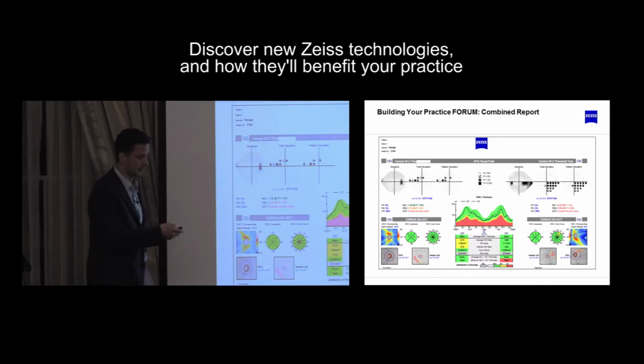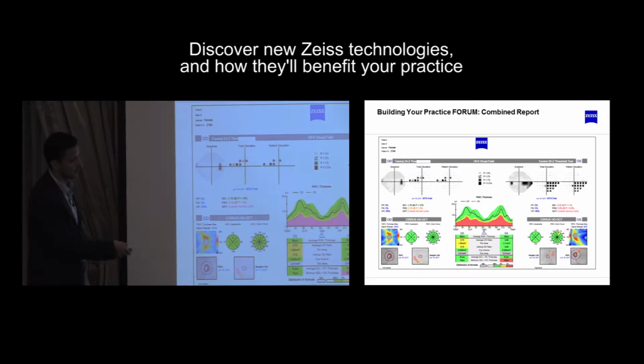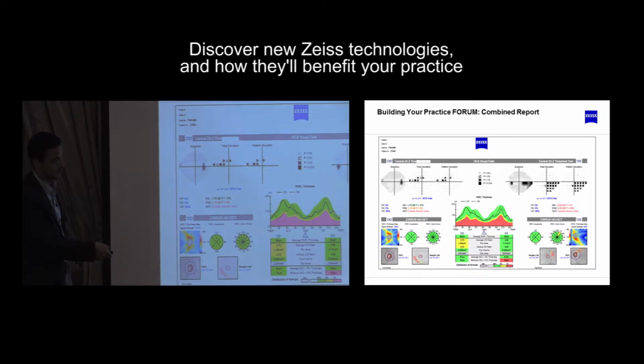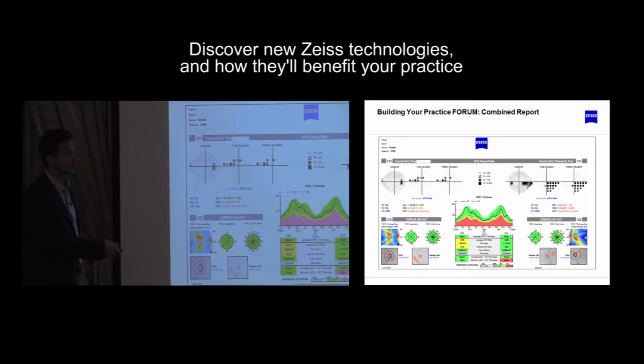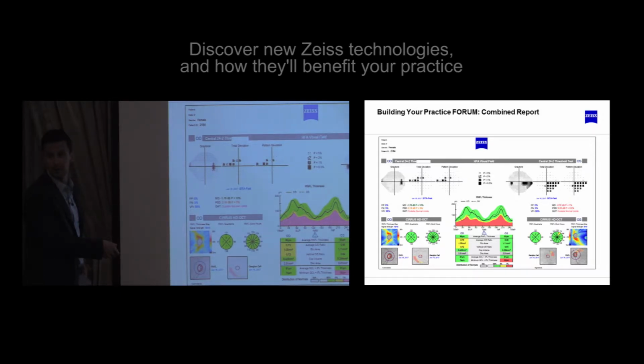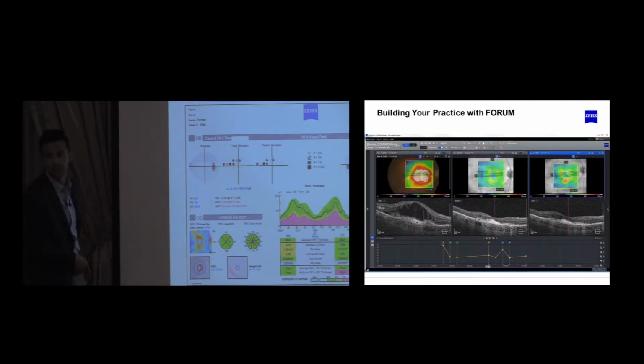You can look at, for example, a nerve like this, where you've got visual field loss here inferiorly, and you can look and go, well, superiorly, yes, there's a drop out of the RNFL. But let's say you didn't have the OCT, but you did have the blue photo where you're getting really good resolution on the RNFL. This is where this is going to be very useful for you.